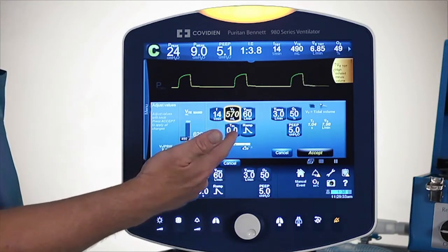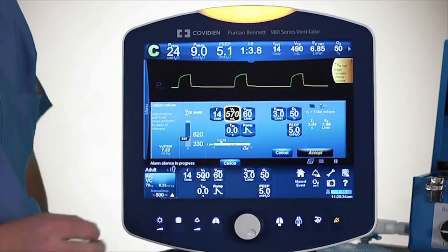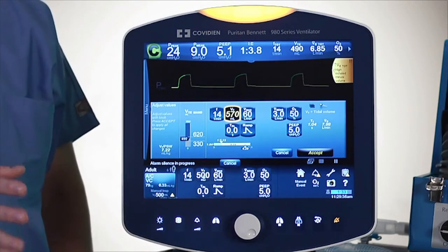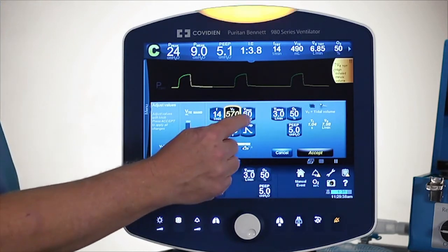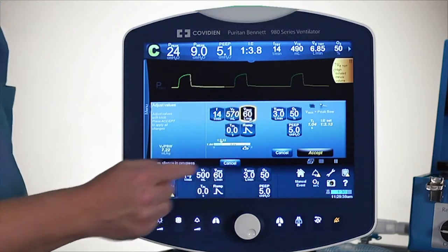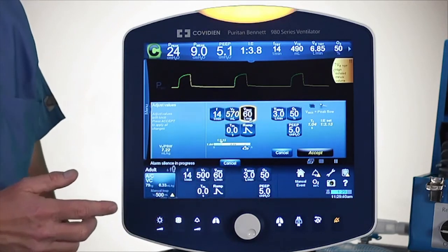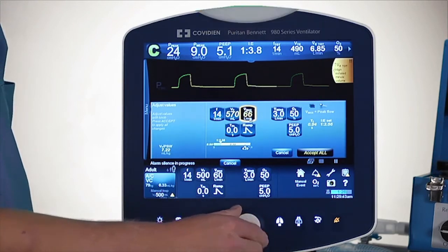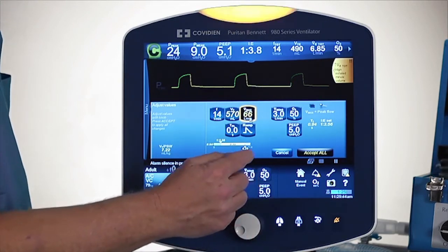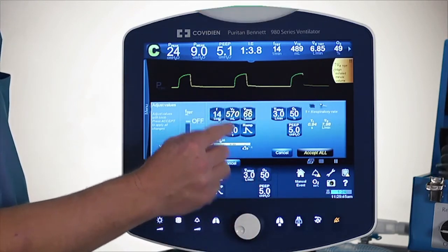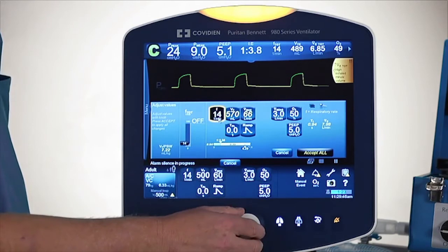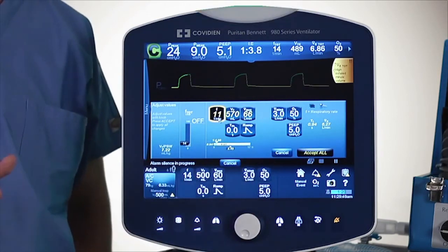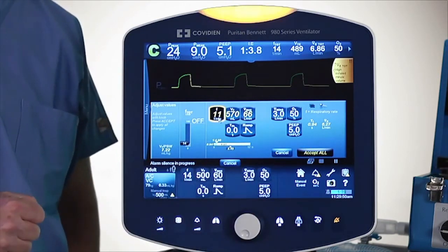So I made a tidal volume change, but I can also do a batch change. With a batch change, I'm going to move right on to the next parameter I want to change and simply change that parameter. Finally, when I'm done with all of the changes that I want to make, I'm simply going to press the accept key once and it takes all of those changes.